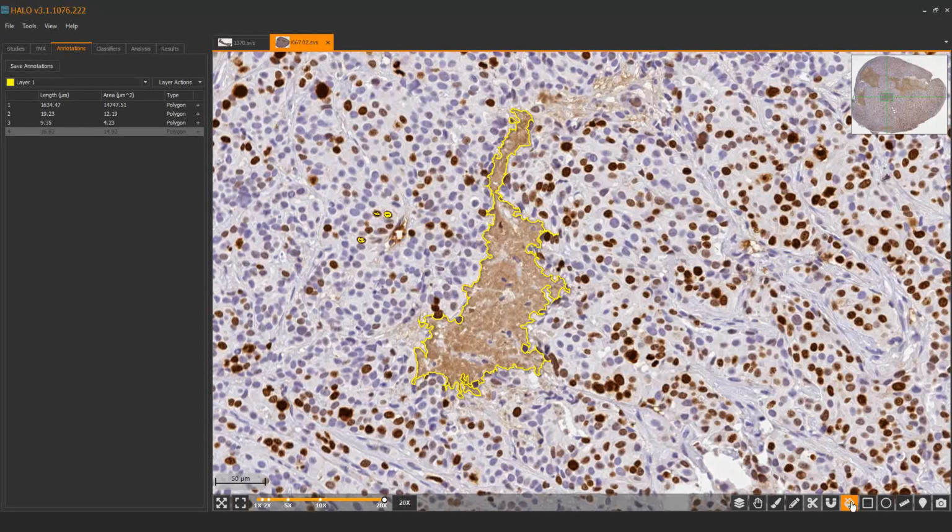You might have noticed I didn't need to go to the tool here to increase and decrease the size because I was using some hotkeys. And those are the open and close square brackets. So if I open the hotkeys out, I get the option to increase and decrease the size of the target. You'll probably become very familiar with this tool. It's often used.